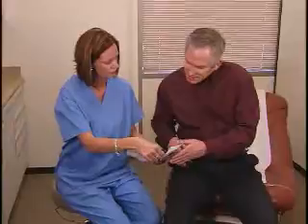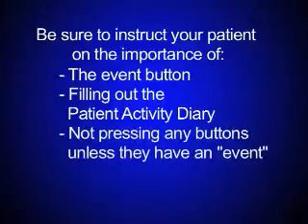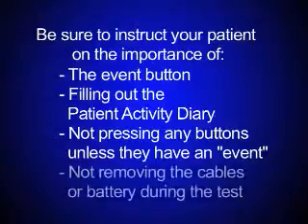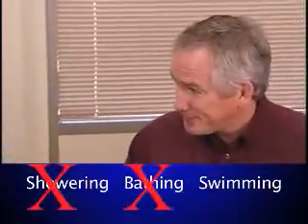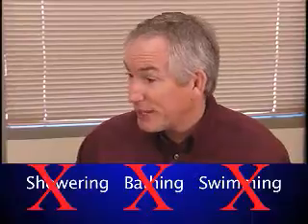Be sure to instruct your patients on the importance of the Event button, filling out the patient activity diary, not pressing any buttons on the recorder unless they have experienced an event, and not removing the cables or battery during the testing period. Before the patient leaves the office, instruct them that the recorder, wires, and electrodes should never get wet. Showering, bathing, and swimming should not take place while wearing the Holter recorder.